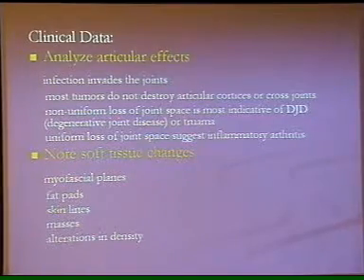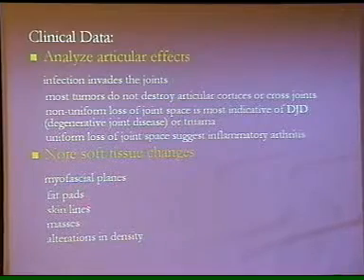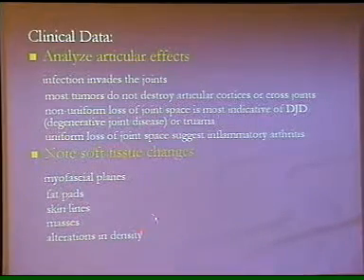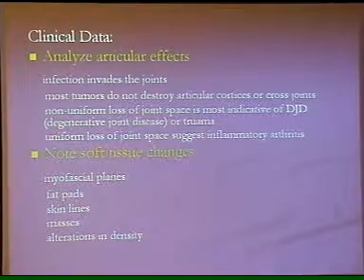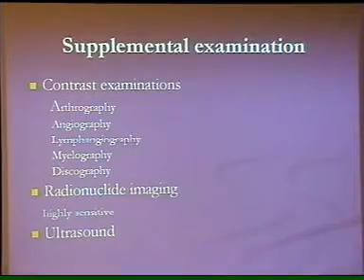Note the soft tissue changes. These are possibilities which you can look for: myofascial planes, fat pads, skin lines, masses, and altered density. Is there increased density? Is there calcification? Is there new bone formation? You can all appreciate the soft tissues.